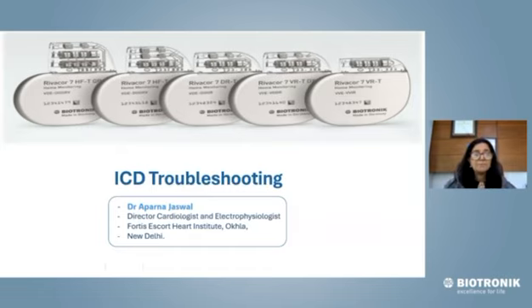However, while I was looking at this slide, you can see the various models that have been placed on it. I often ask my fellows, and they often know the NASPE BPEG code for pacing. But whenever I ask them, what does VVE mean? Can you see this?